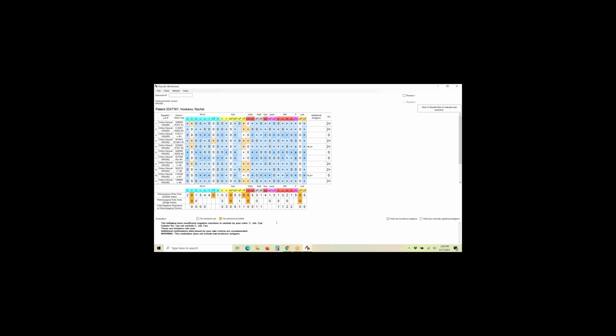So we've got a pretty good indication that we're probably dealing with a C and a Duffy A, but we have an issue here, and this is another one of those things similar to F with Immucor. With Ortho, there's JSB. A lot of times they don't give you the JSA typing to tell you if it's a single or double dose expression. So Antigen Plus is not going to count it and exclude it.